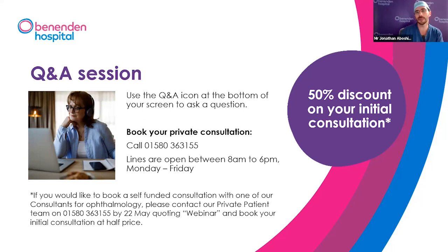There are some eyes that wouldn't be suitable for multifocal lenses, and that's why we do a quite in-depth workup, or even occasionally for torics, though that's quite unusual. So we'd always advise you what we think are suitable options, and then you choose from them. That would be the proper way to do it.